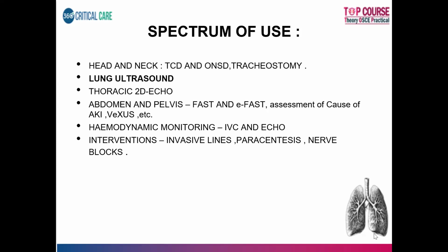2D echo, again, a lot of abdominal scanning, be it your EFAST, etc., in emergencies, or fluid dynamics, assessment of volume status, and a lot of other things that you can think about. So much so that it is even being used for assessment of nutrition these days. So the use of ultrasound is increasing day by day, and the better we understand it, the better we'll be able to apply it and have better outcomes at the bedside.